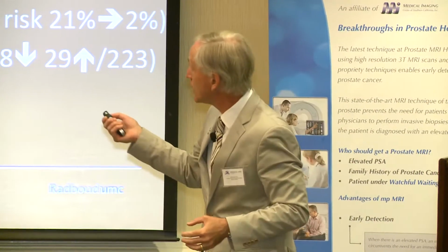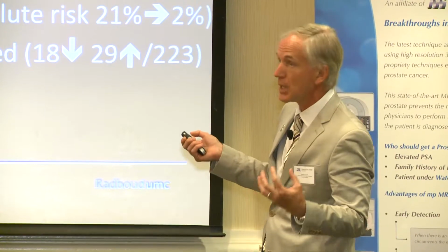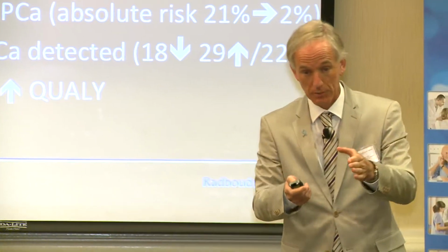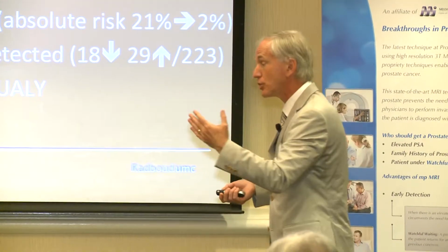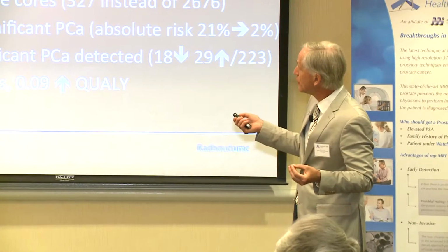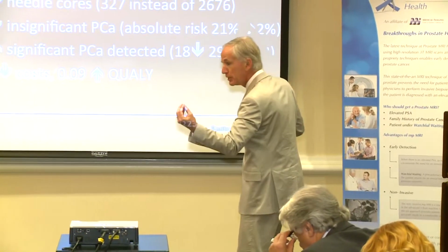And they all agreed in having an MRI. And the MRI was interpreted, so was read with the so-called PI-RADS criteria, objective criteria. And all the men with a suspicion of prostate cancer, that means PI-RADS 4 and 5, they had an MR-guided biopsy. Now, first of all, patients without a suspicion of prostate cancer. That was more than 50% of all the patients. And if you choose this strategy versus TRUS, it will reduce the number of biopsies by 50%. In the US, that will reduce the number of biopsies by 500,000 men per year.